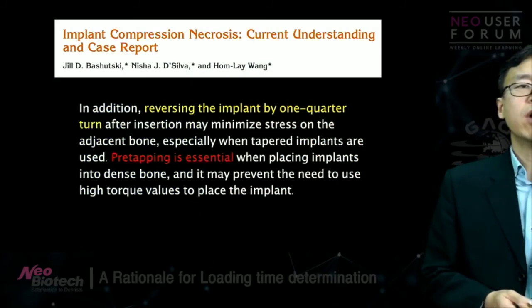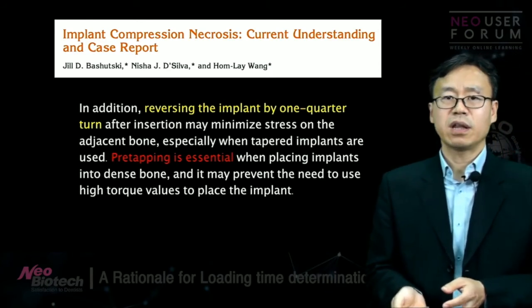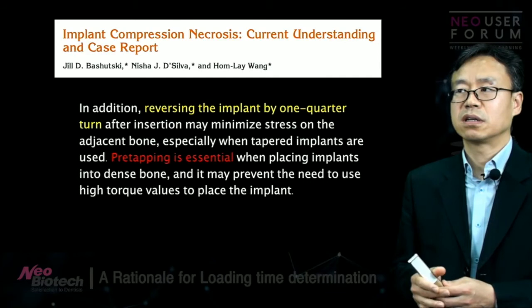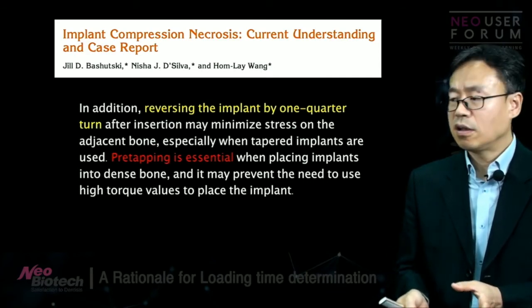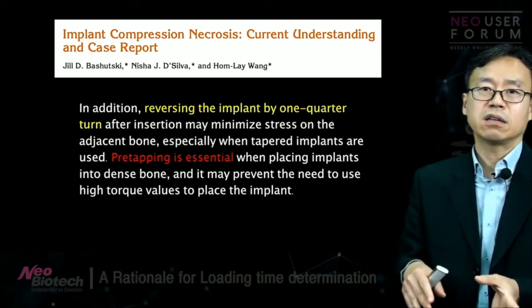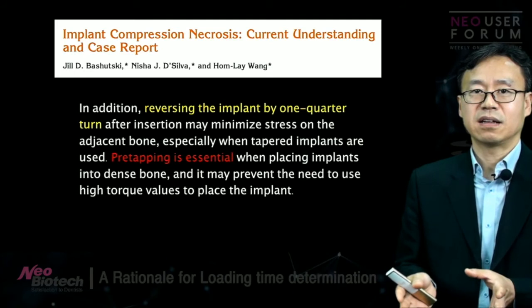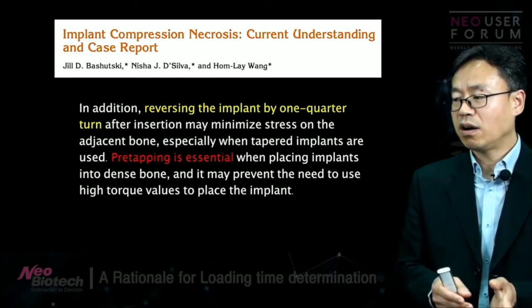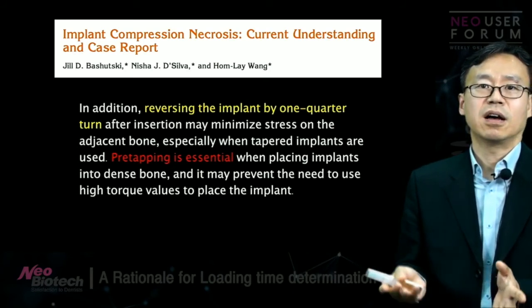What Dr. Homley Wang suggested from this case report was two things. Either you relieve the pressure by untorquing, unscrewing the implant slightly after you place the implant, or simply use something like a tap.